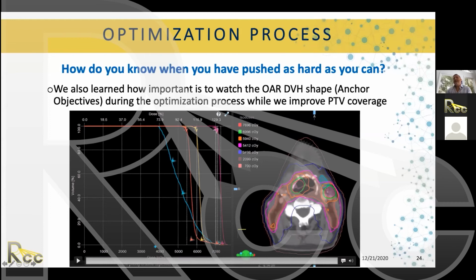That was unnecessary. If you had a good coverage, you leave it there. But if you think that the coverage needed to be improved, then remember that we said you can move those anchors, because I know the constraint I was putting on the submandibular was not helping with the coverage in these two structures, but it was good to begin with.